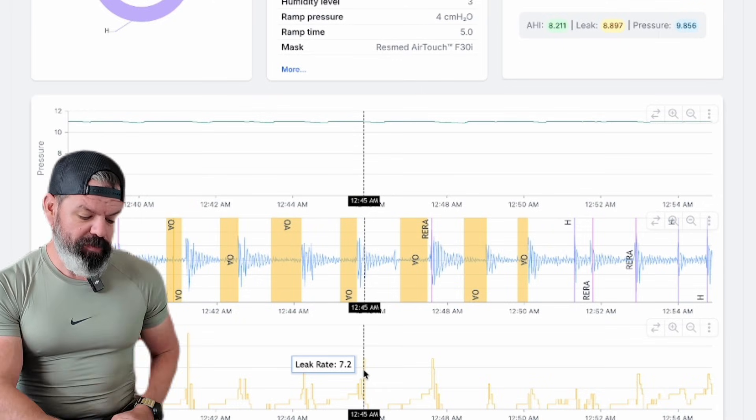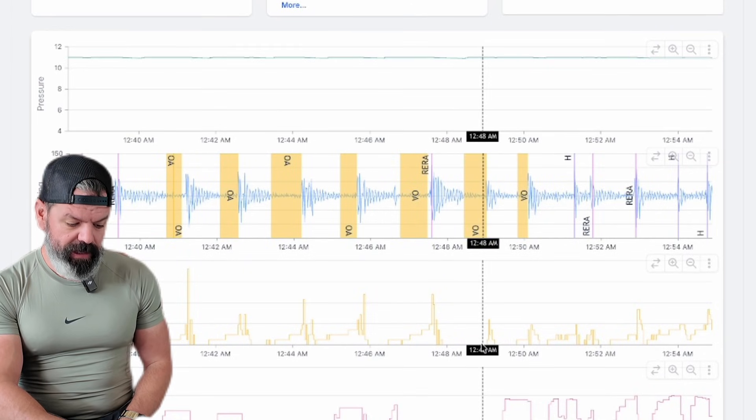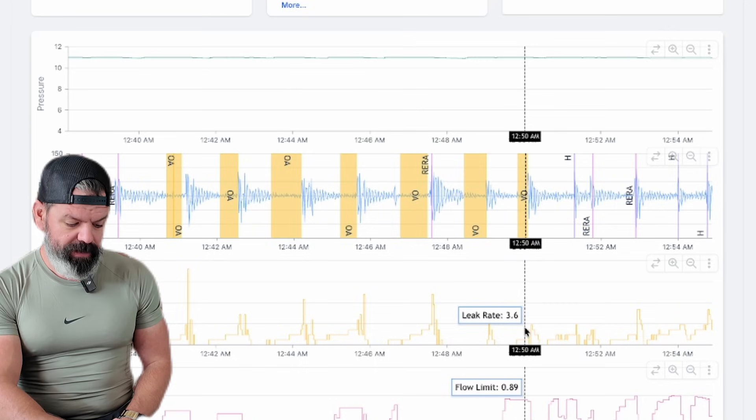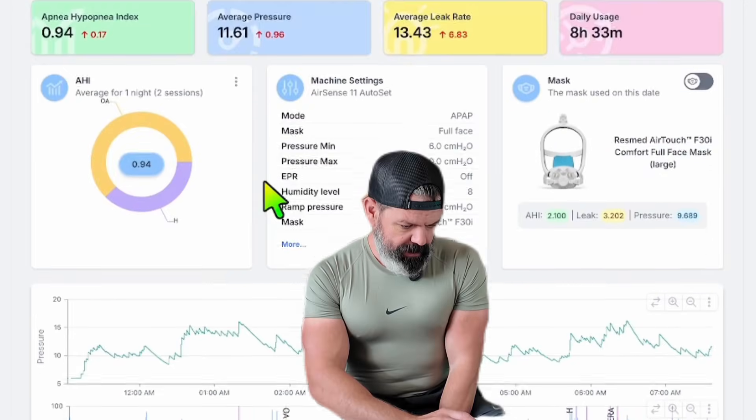It might be a bit confusing, but you can see it here — there's no leak here, then leak, no leak, leak. Let's go to the next one.